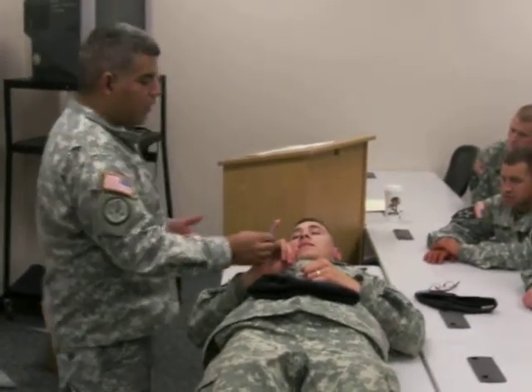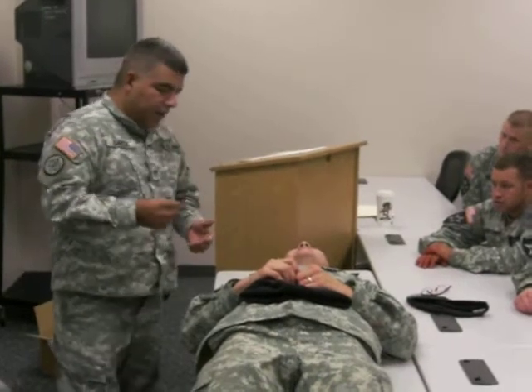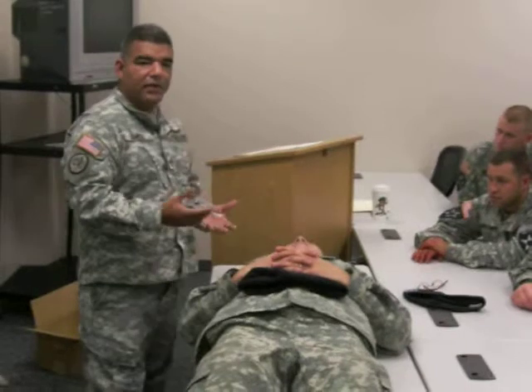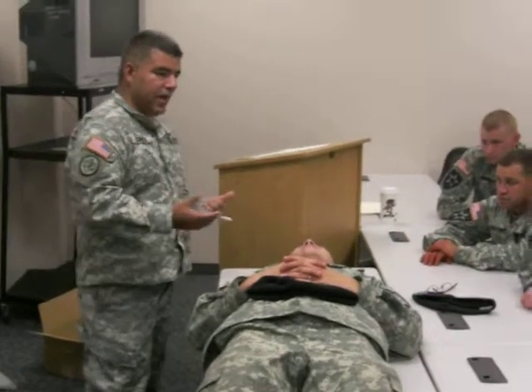Okay, if we look here, we can see that this is smaller than his nose, or it's smaller than his pinky, so it should fit into his nose. All right. First thing we're going to do, like I said, is assess the need for an airway. He's breathing right now. We're going to assume he's breathing at 8 or less. So that gives us our indication that he has an inadequate airway.